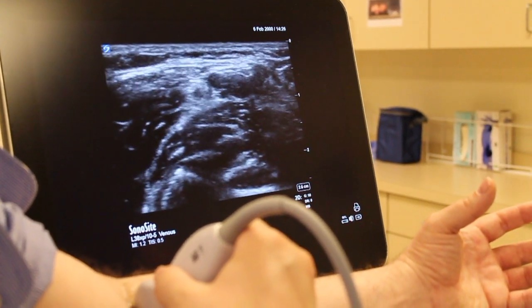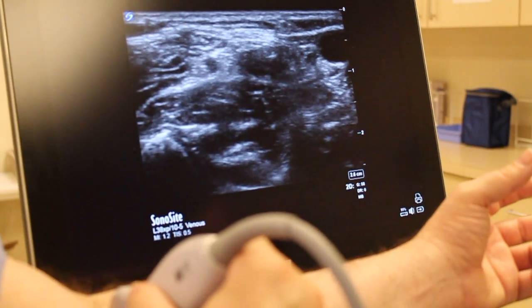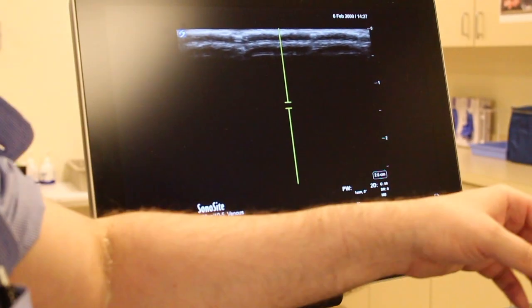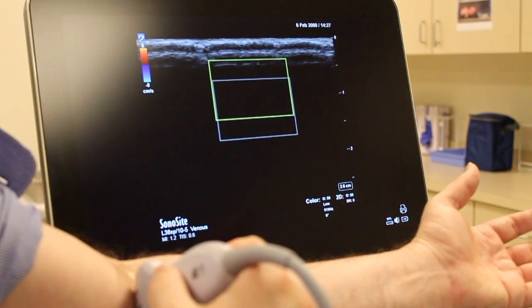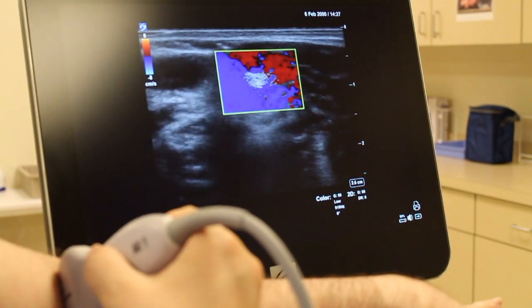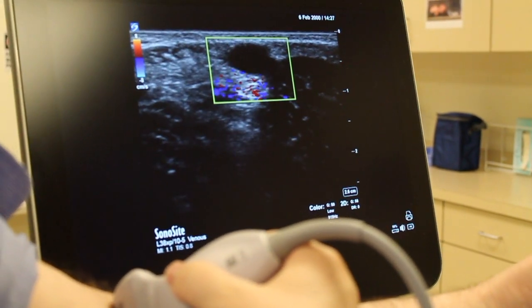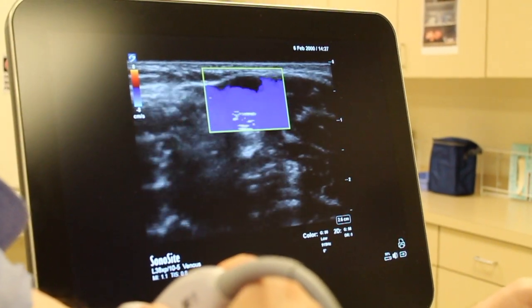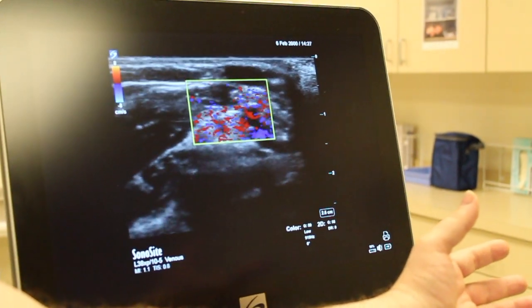Is that an artery or a vein? We're going to look and see if it pulsates. When I compress, there's actually a deeper structure here that doesn't compress as easily — it will compress if I push hard on it, but that's a pulsating structure. So we're going to go ahead and put some color on and see. Let's bring this up a little bit and see if we can see those structures. I don't see a lot of flow through that, so that's probably venous, and when I compress it, it crushes down pretty well.